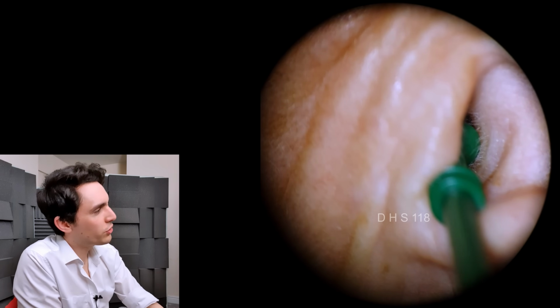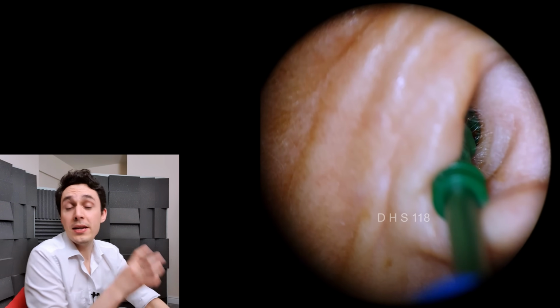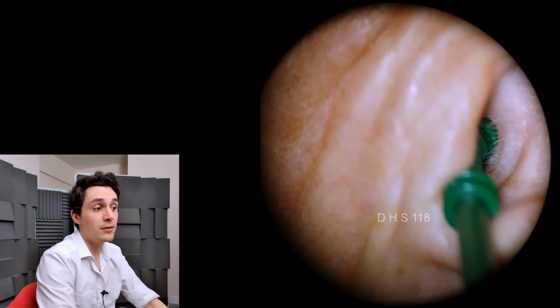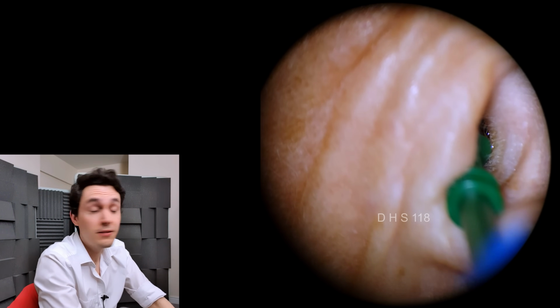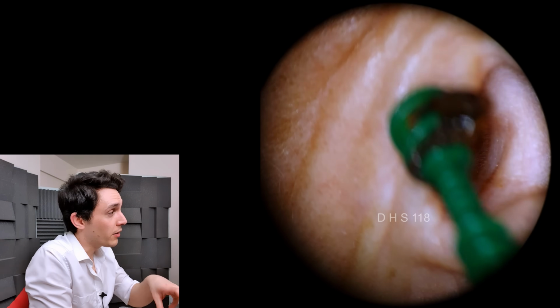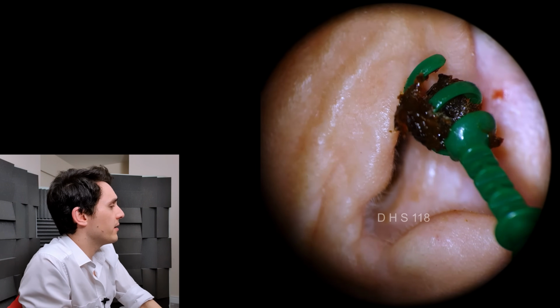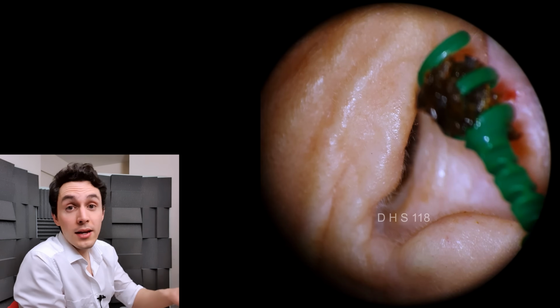The trick to using this, what I found, is that before you go in and select a device, have one more look at the ear canal to make sure that you're choosing the appropriate size. If you can accommodate a large, then it's best to go for a large, because that will retrieve more wax in one go. So there's the final piece, again caught nicely in the spiral of the device.